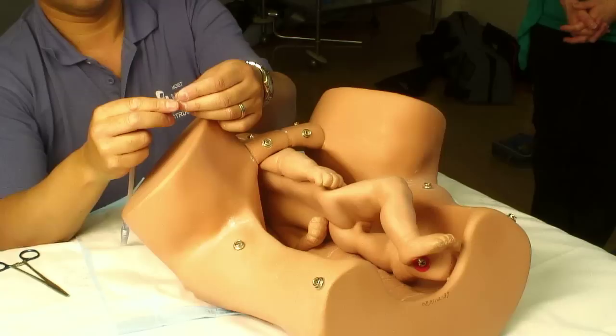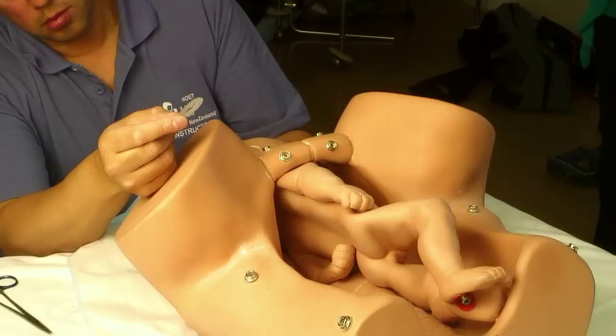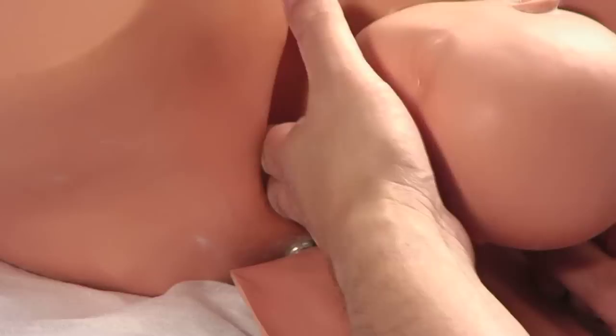Posterior auxiliary sling traction is a technique used in the management of shoulder dystocia where standard manoeuvres have not succeeded in delivering the posterior shoulder. You take a fine piece of plastic tubing, such as an infant feeding tube or a nasogastric suction tube, and fold it in half, keeping a loop of about two centimetres at the end. You feed that through the baby's posterior axilla from back to front, and you catch the loop with your other hand — your left hand — and pull it through.